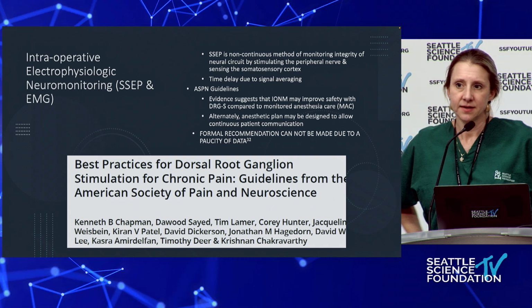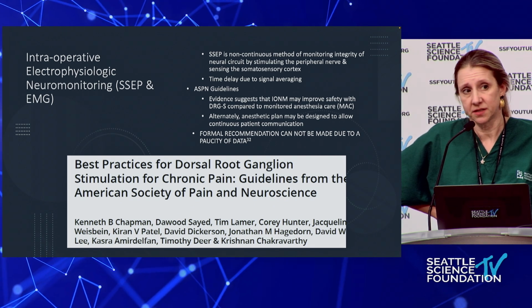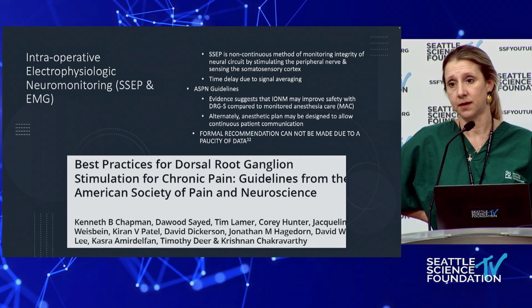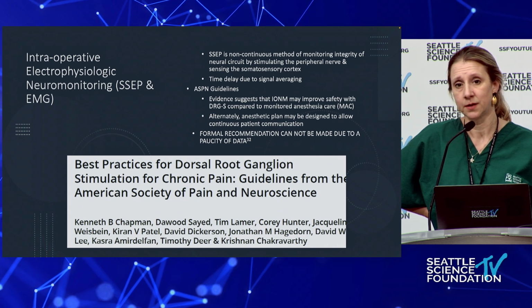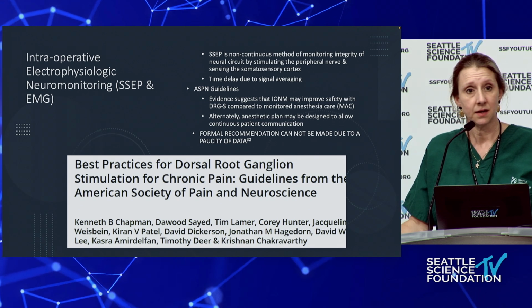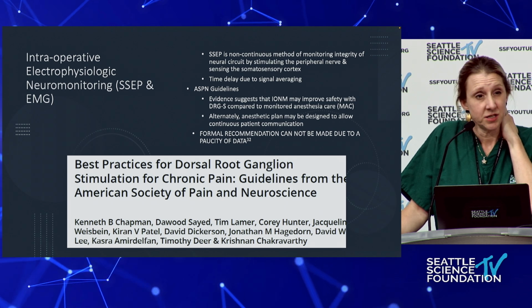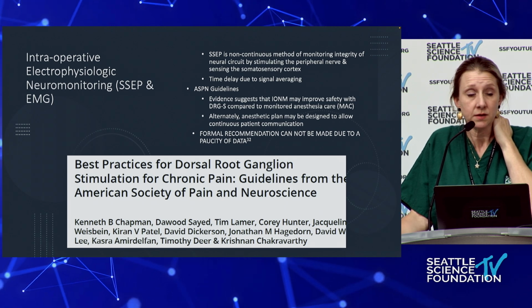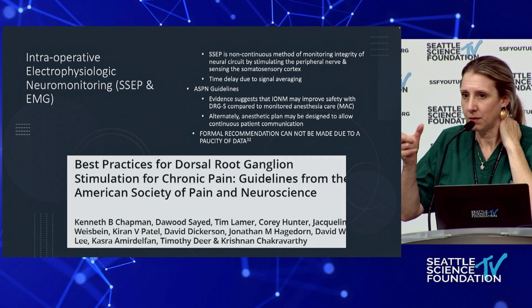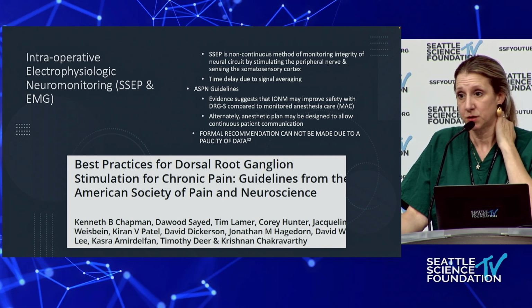So we have a lot of data now about the efficacy of using conventional neuromodulation. Nevro published recently on diabetic peripheral neuropathy, and we're seeing this reproduced in other company studies as well. So we can see now that there's strong efficacy for being able to achieve stimulation down to the feet with some programming modalities, but I would suggest thinking carefully about your situation. If it's a unilateral distal limb, or if there is a monodermatomal neuropathic pain syndrome in the thoracic or lumbar spine, this may be the procedure for you.